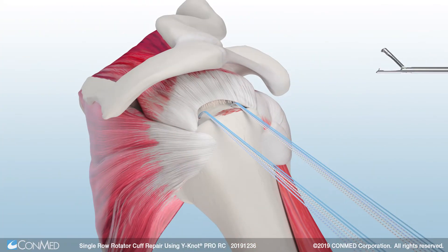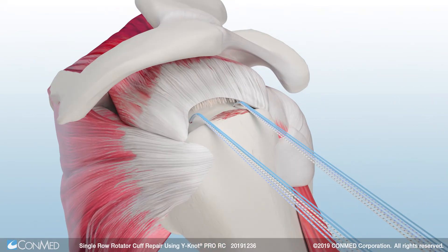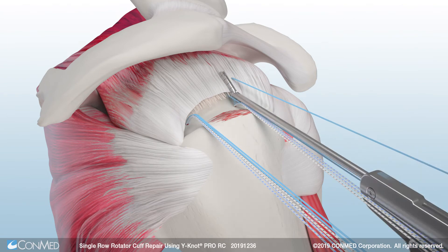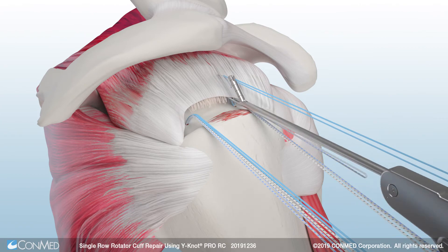ConMed's Spectrum Auto Pass Suture Passer reliably passes suture in thick tissue and gives the surgeon the option of capturing the suture in the trap door. Use the Spectrum Auto Pass to pass all the suture limbs from each anchor through the remaining rotator cuff tissue.